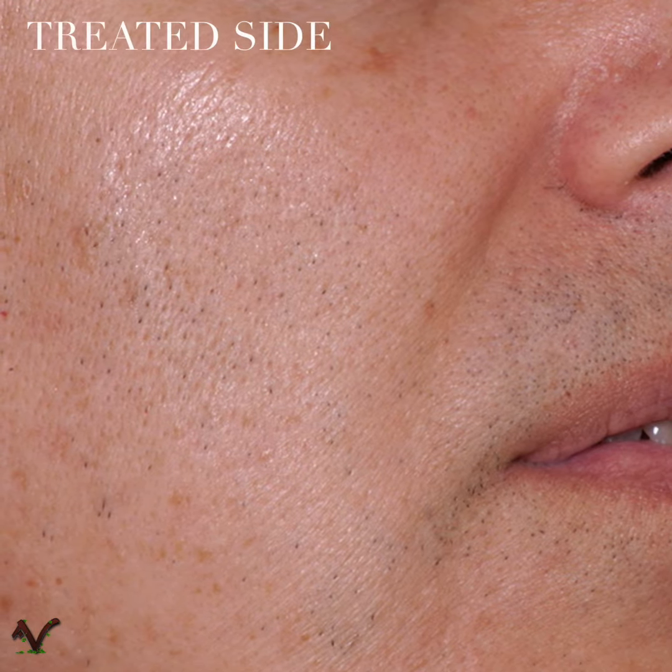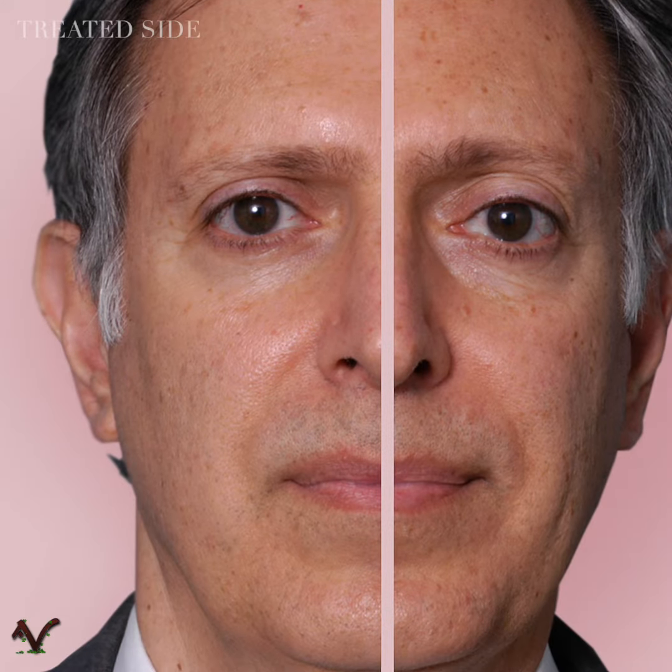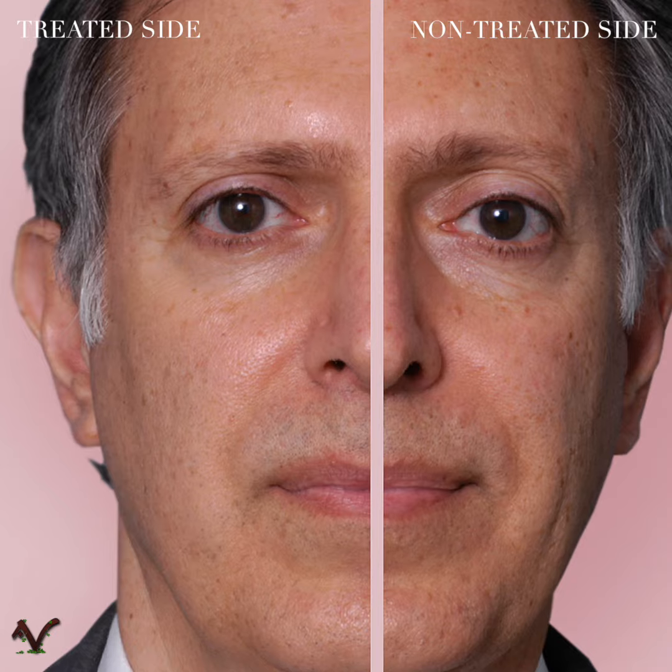When I look carefully on the right side of my face, the discolorations are less, the fine lines are less, and the skin texture is much younger looking.